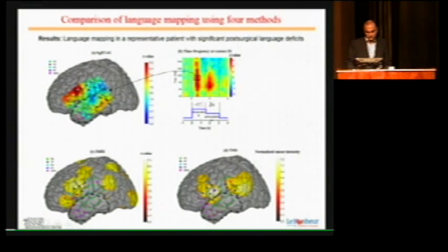And these two electrodes in black, which you see in all pictures, are two electrodes identified by CSM as a language area. As you can see, these two electrodes are far from the resection area, so there is no resected electrode identified by CSM as a language area, and this is actually the clinical practice, that the surgeon usually tries to stay far from the area identified by CSM.